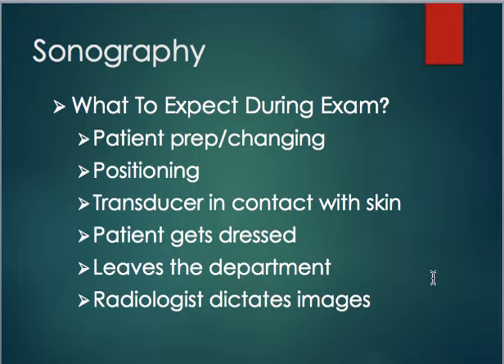So what should patients expect from exams? They're overall fairly simple. The patient might have to change. There is some prep, and we'll break that down just a little bit. But if the patient preps, that's prior to the exam. When they come into the hospital, they may have to put a gown on, they may have to change. It's going to depend on where you're scanning. Carotid, heart, things like that, you're going to have to change and put a gown on. Sometimes for abdominal ultrasounds, you can just lower your pants a little bit, move your shirt, things like that. But it's going to be dependent on the hospital, the technologist, and what you're doing.